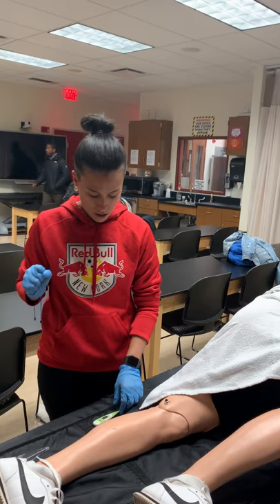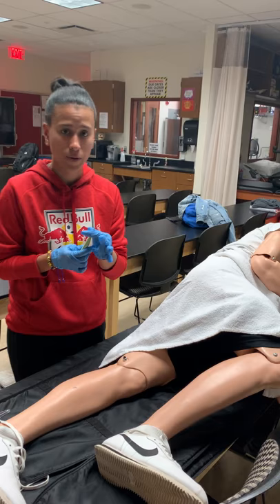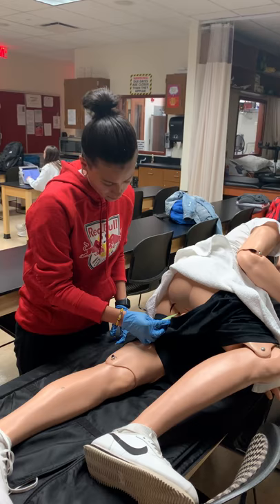First, we're going to make sure we have gloves on. As soon as we have gloves on, we're going to make sure we put a little bit of lube on it. That way, you can enter the bum easily.